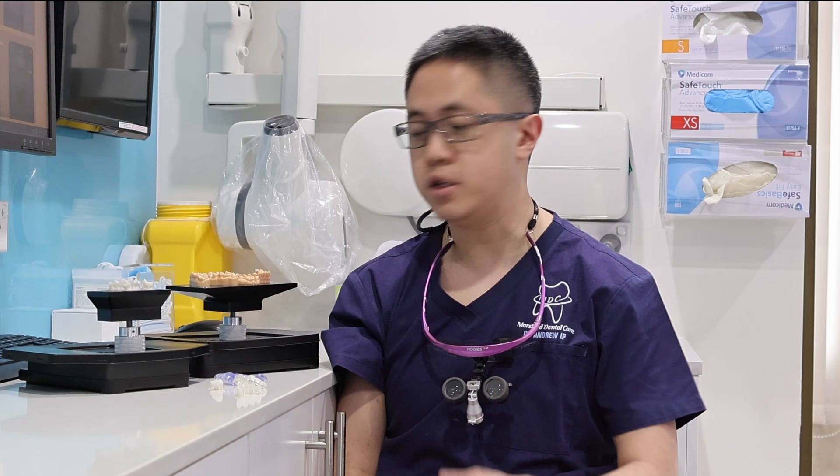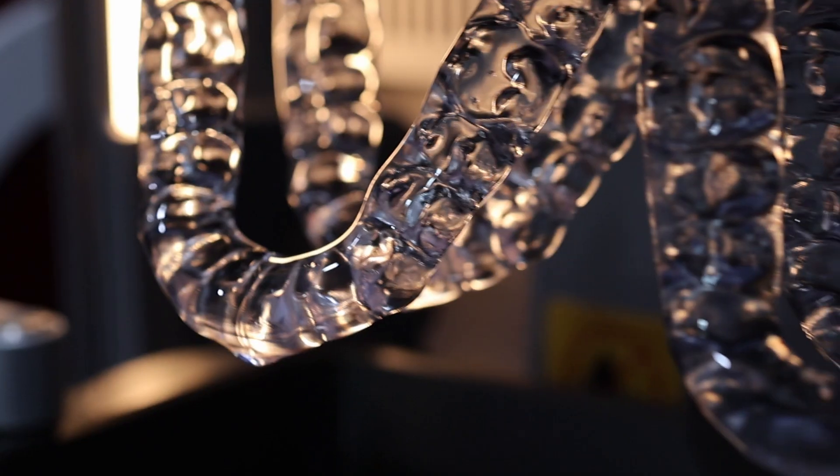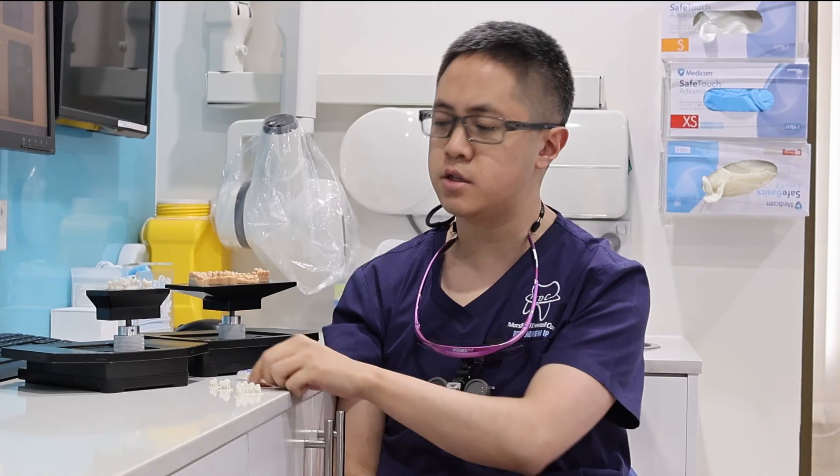It is honestly one of the most cost-effective options out there in the market, and you can print anything from your models, your crowns — temporary and provisional — splints, surgical guides, anything that you want to print in a general dental setting. You can do so predictably, reliably, and consistently with this particular setup.